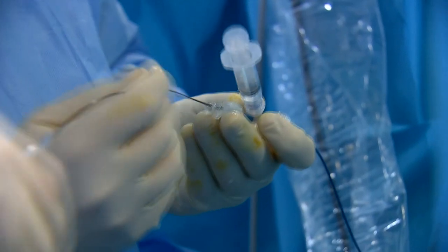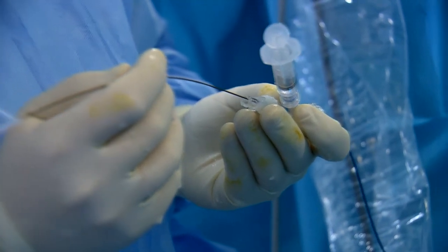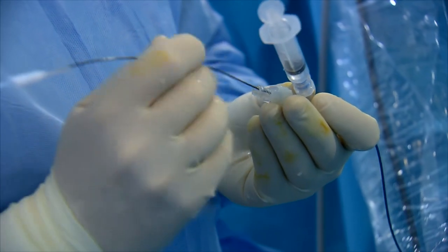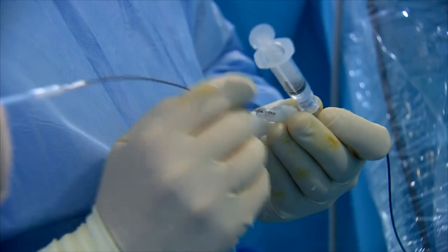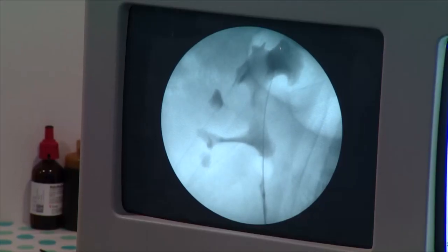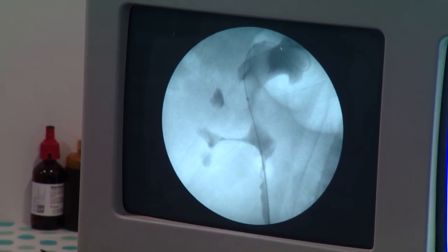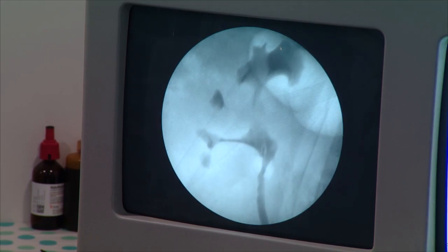Okay, now X-ray, please. More? Okay. Put that back, keep it. Now X-ray. Now we can see the X-ray, please. Okay, this is the balloon. More X-ray, please. Okay, and stop.